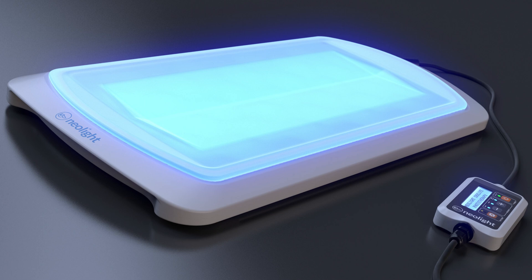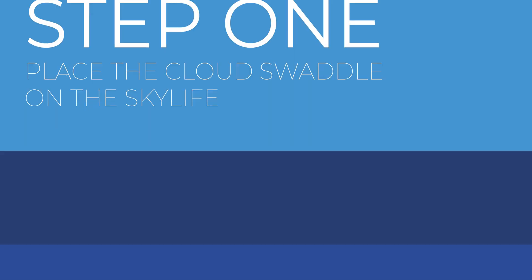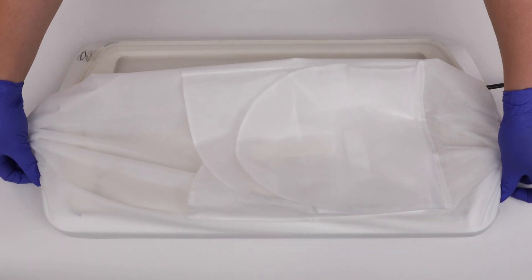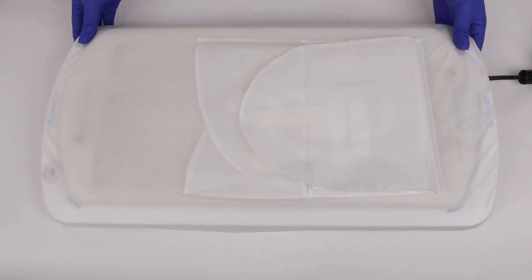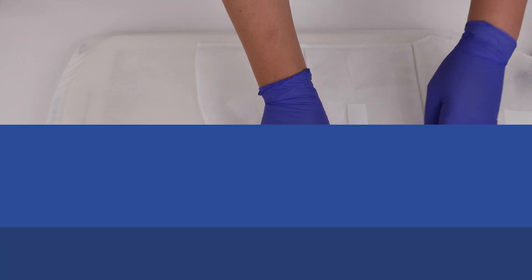We will now walk through each of the steps to effectively use the Skylife system. Step 1: Make sure the Skylife phototherapy system is facing up with the gel pad on top. Place the cloud cover on the device over the gel mat, and secure the cloud cover to the device using the corner pockets like a fitted sheet.